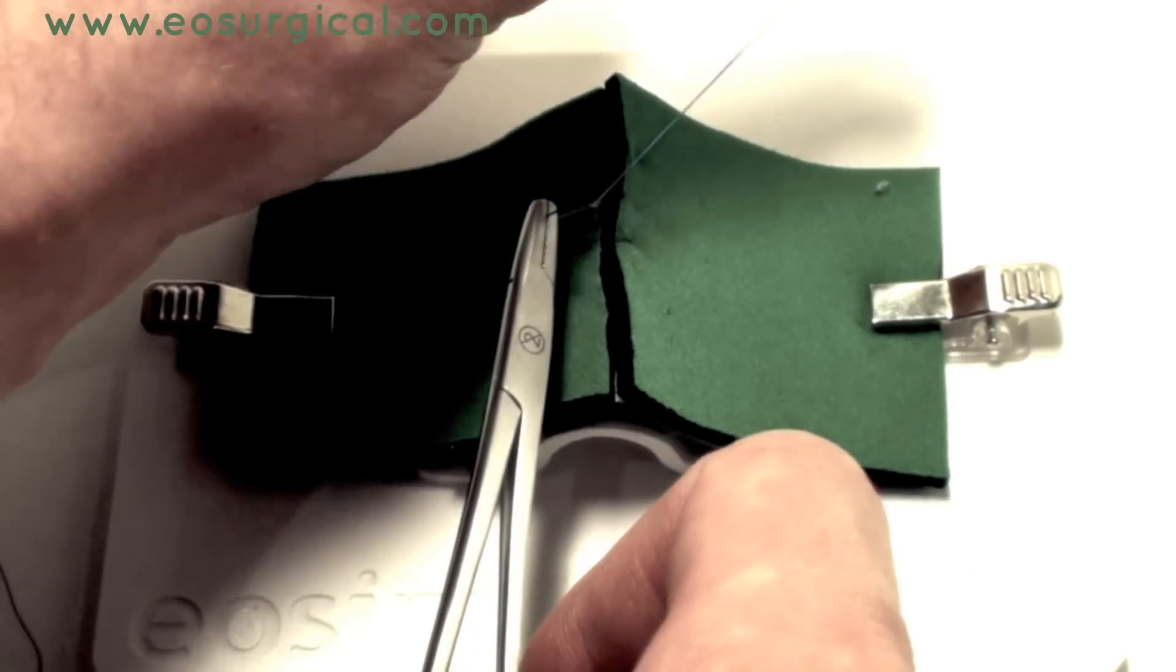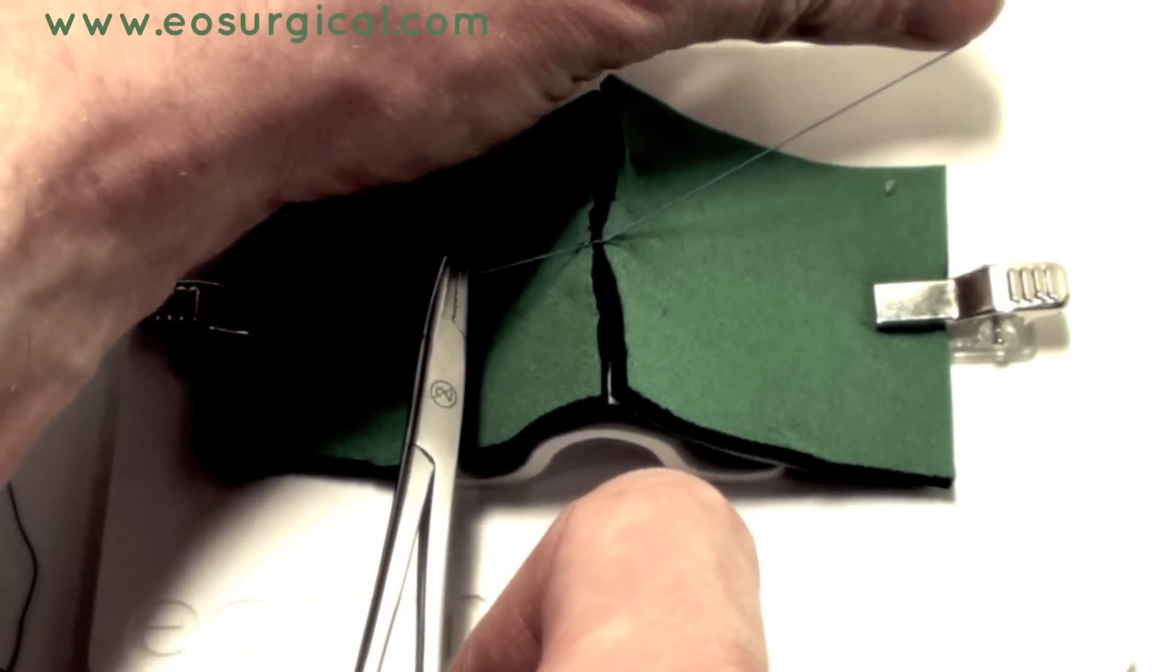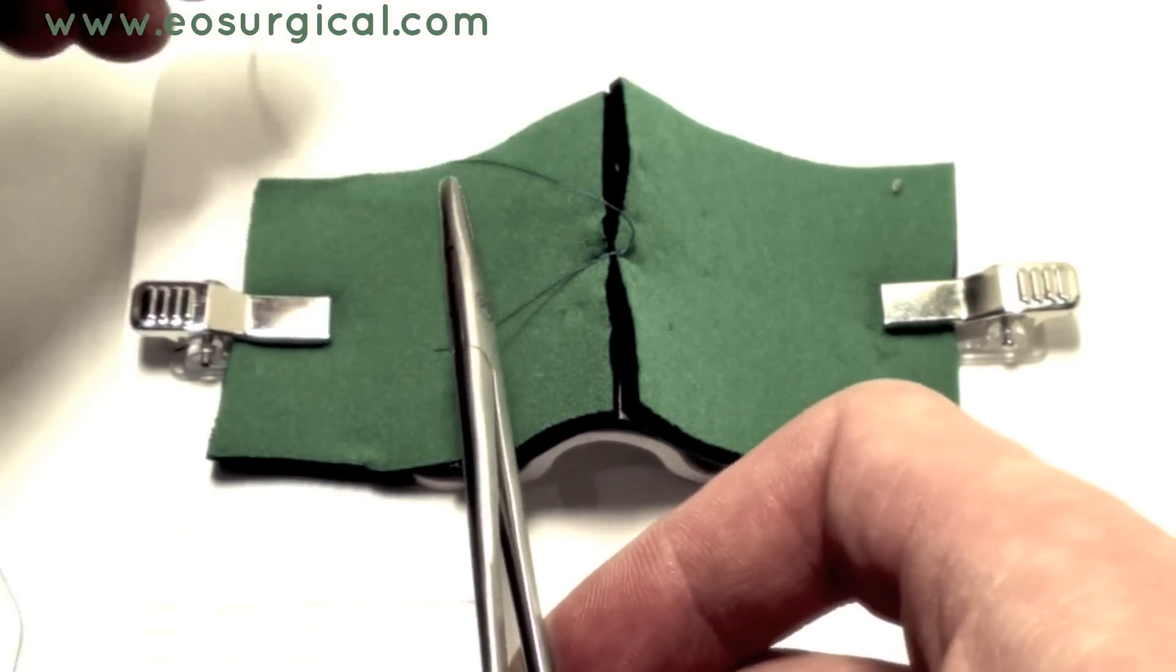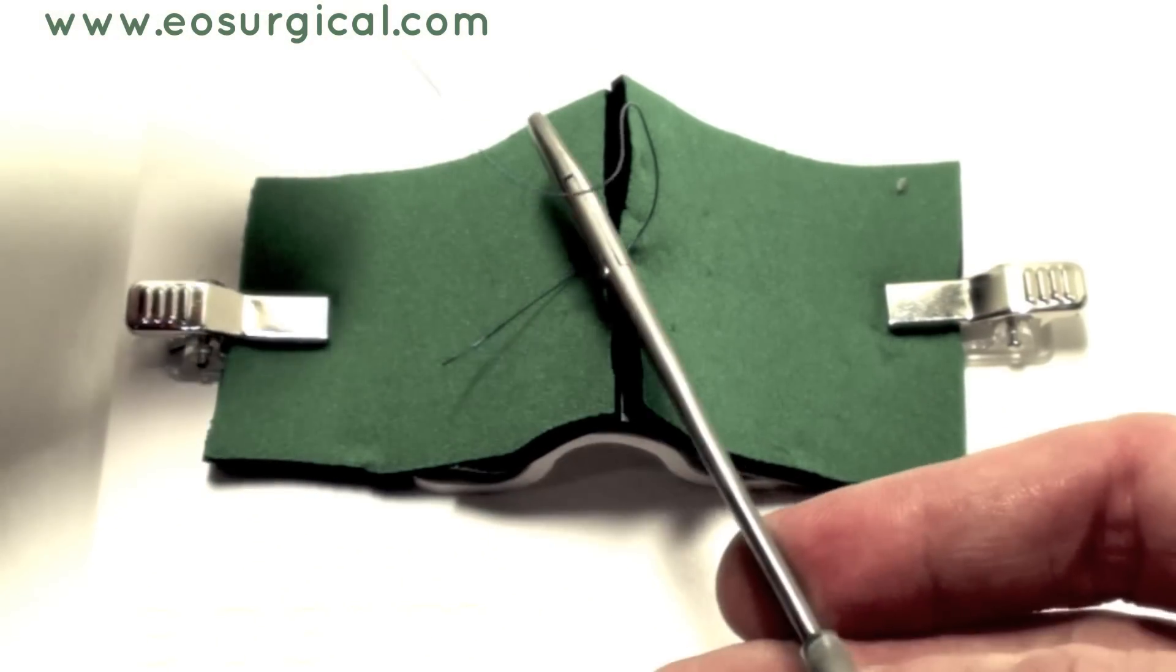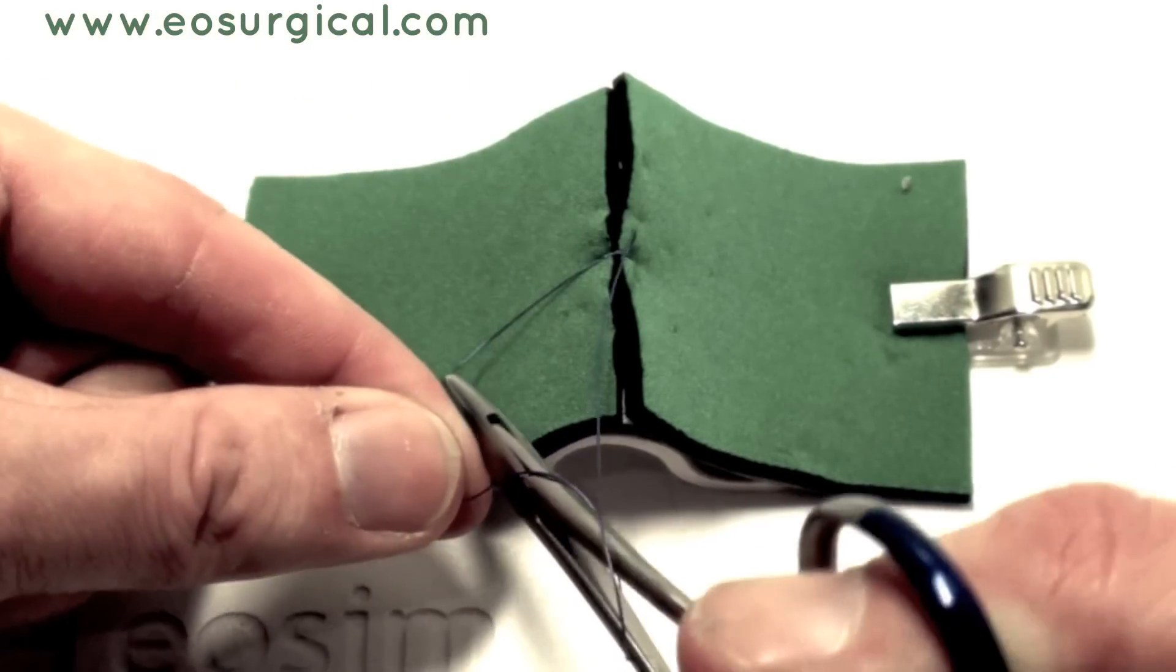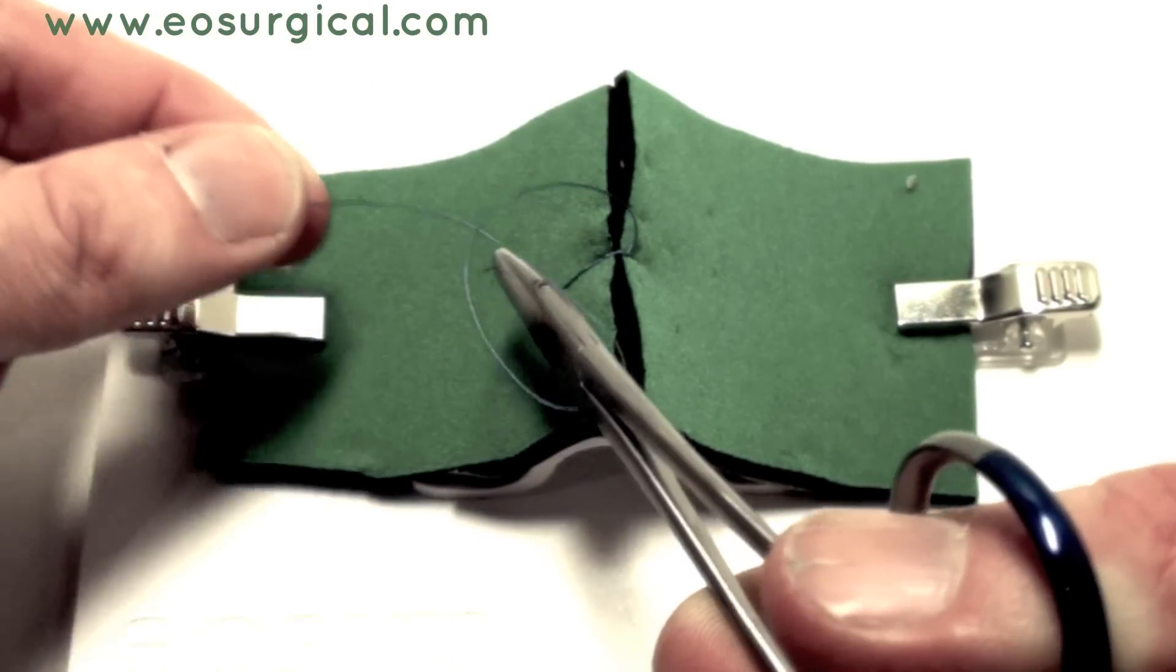Now, when you pull the short end through the knot, you need to cross your hands over. Looking from the other side, from the short end to the long end, wrap it around once this time, and pull the short end through, again crossing your hands.